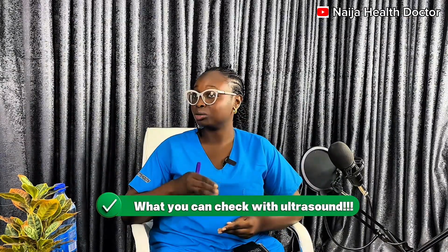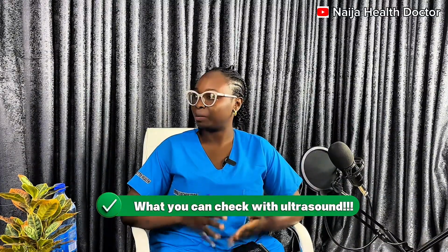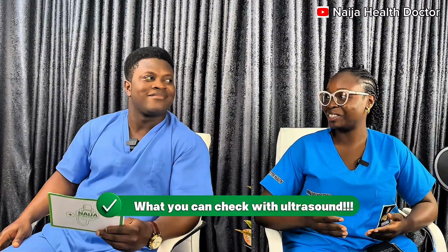What and what can we use ultrasound to get? If someone said, I'm feeling this pain, it is ultrasound that will work for that one. So there are clinical conditions that you can use ultrasound to check. We have conditions like fibroid, ovarian cyst. Then we have pregnancy is a clinical condition.